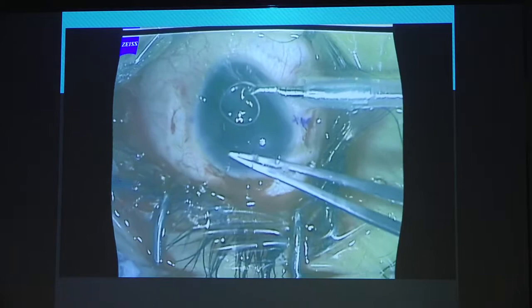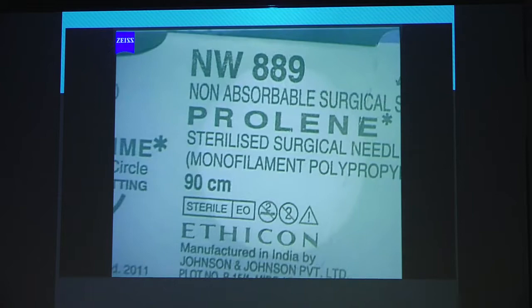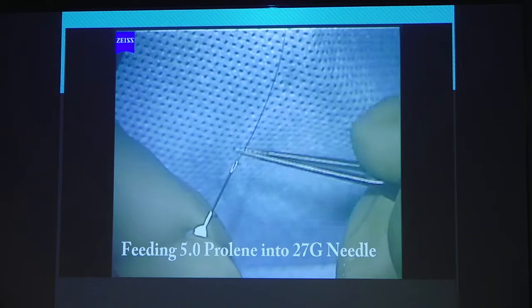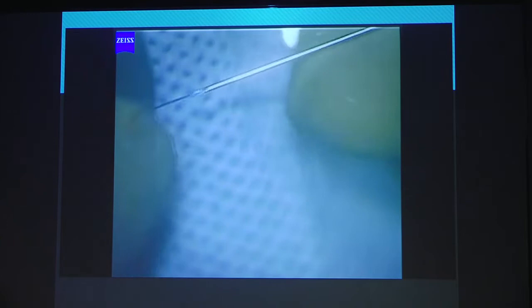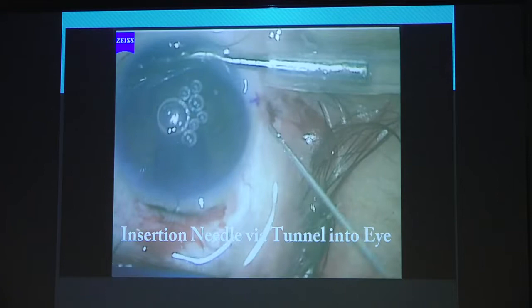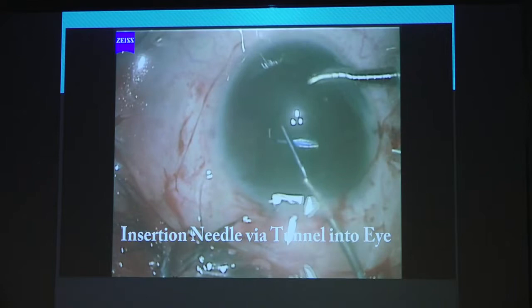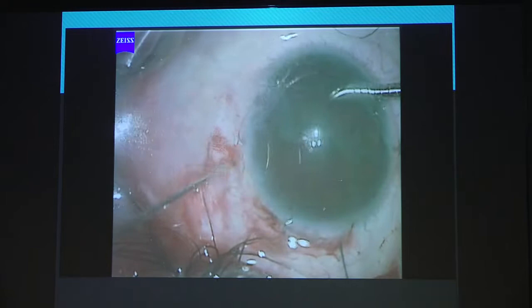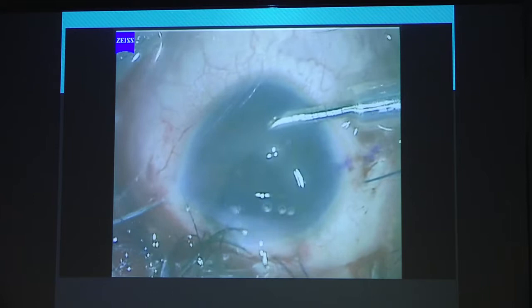Now you take prolene — 5-0 prolene, freely available, doesn't cost anything. Take your prolene and thread it into a 27-gauge needle. No gymnastics, no rocket science, just follow these steps. Thread it through the tunnel you made, then bend the needle at 90 degrees and push it in. Hold your suture and pull it out. Same way on the other side — bend your needle at 90 degrees and put it in, hold your suture and take it out. Remove your needle. So you have 5-0 prolene on both sides.